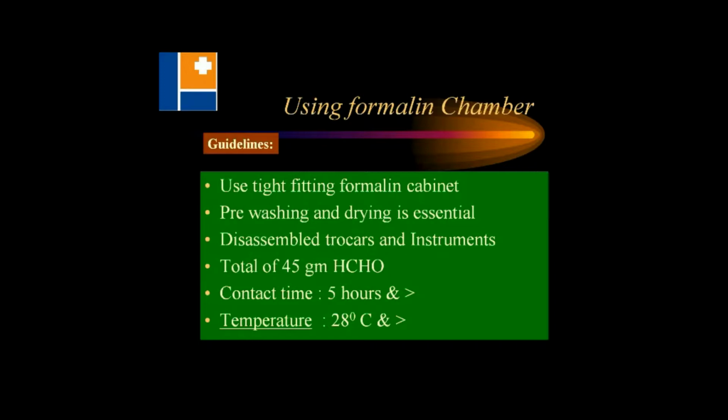We have done a study where we found the formalin chamber is effective, if at all, only if we use a tight fitting formalin chamber, and we keep the instruments after doing a proper washing and drying, and the instruments should be kept in a disassembled condition, and we should keep at least 45 grams of formalin tablets, that is 45 tablets. There are 15 tablets in each tray, so if we have 3 trays in the chamber, and we should keep the instruments for minimum 5 to 8 hours, ideally overnight, in order to get some decent disinfection.